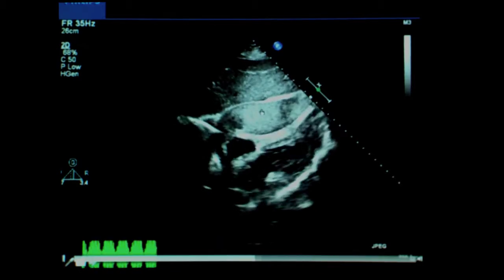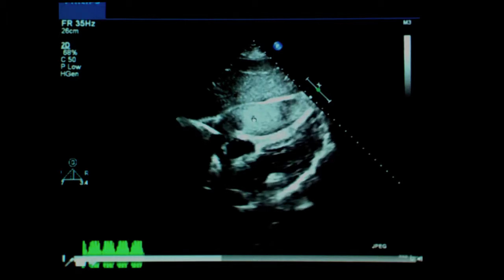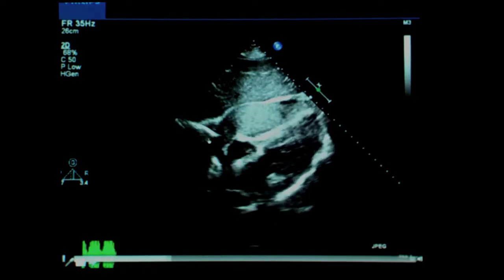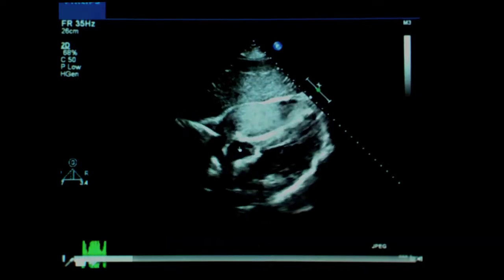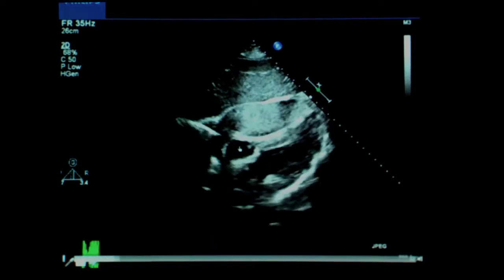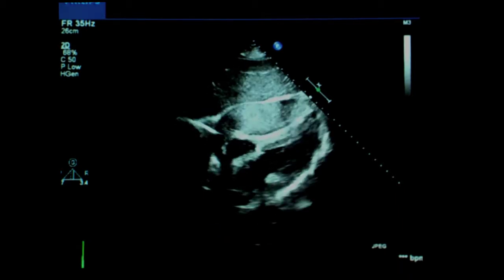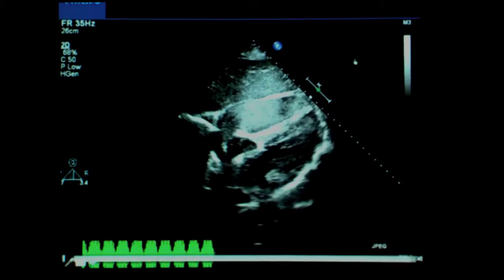You can also see where the right atrium should be, there are these hyperechoic bubbling densities. That's spontaneous echo contrast, right? From stasis, absolutely. You see spontaneous contrast with low flow, even without injecting anything into the venous system. So it's loculated. So this is the posterior pericardial space. There's nothing there. It's all anterior, compressing the RV.